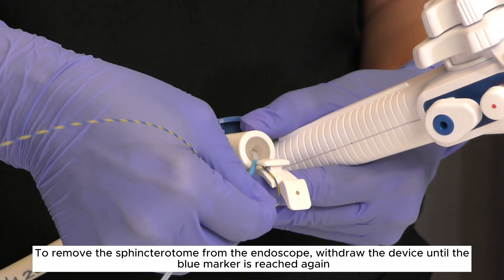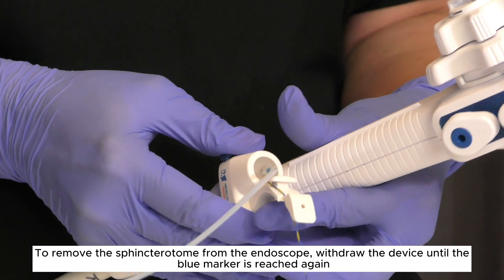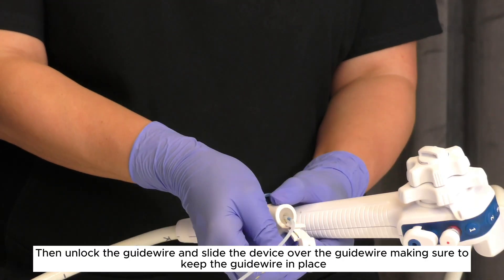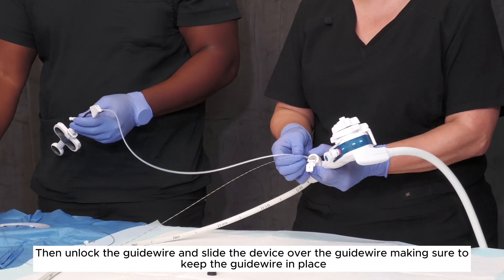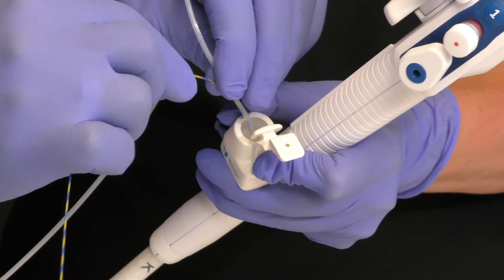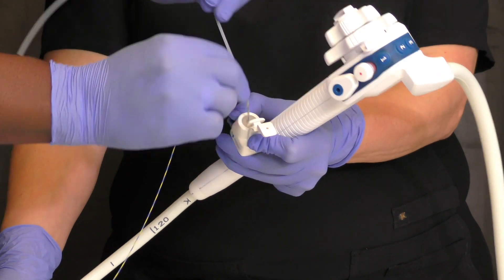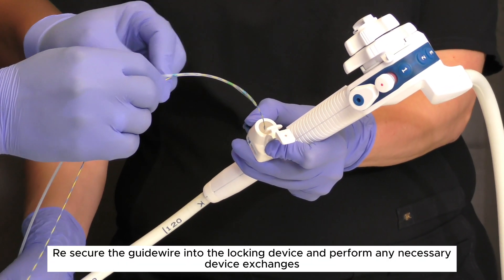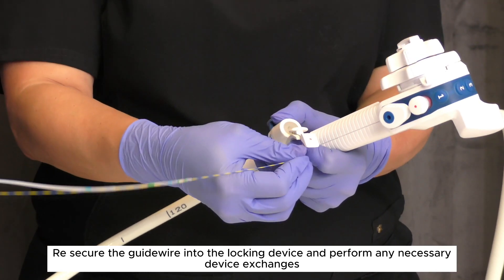To remove the sphincteratome from the endoscope, withdraw the device until the blue marker is reached again. Then unlock the guide wire and slide the device over the guide wire, making sure to keep the guide wire in place. Re-secure the guide wire into the locking device and perform any necessary device exchanges.